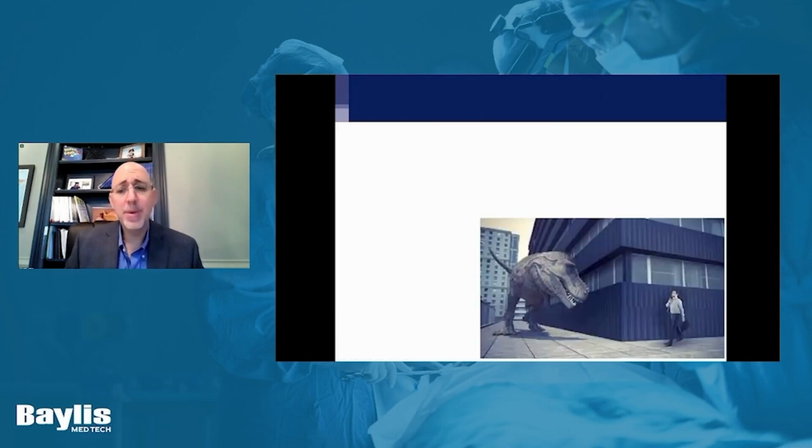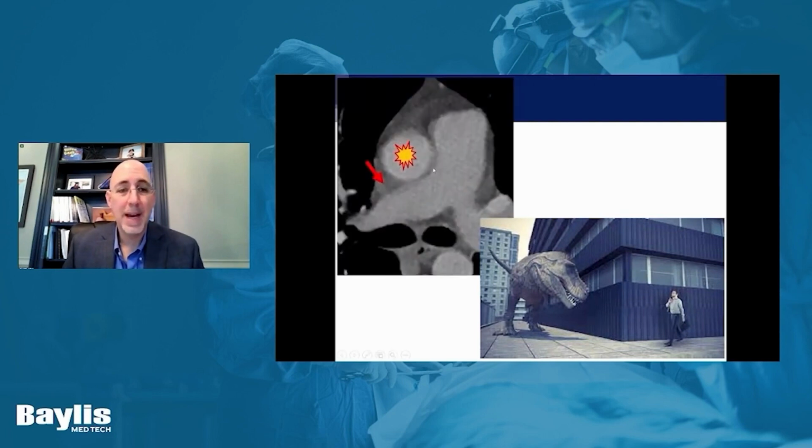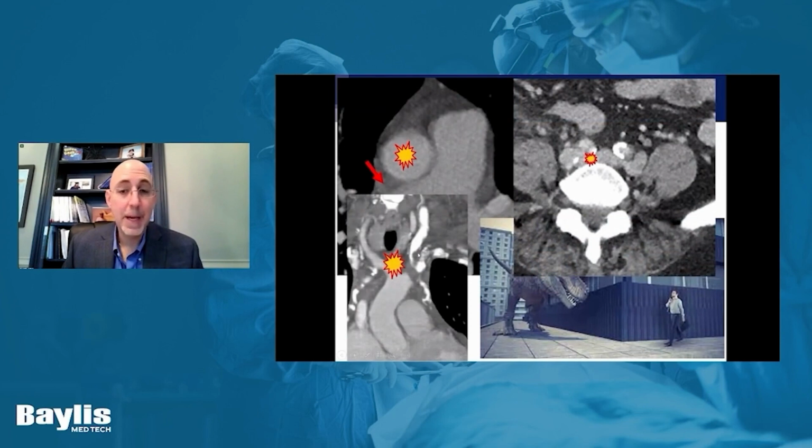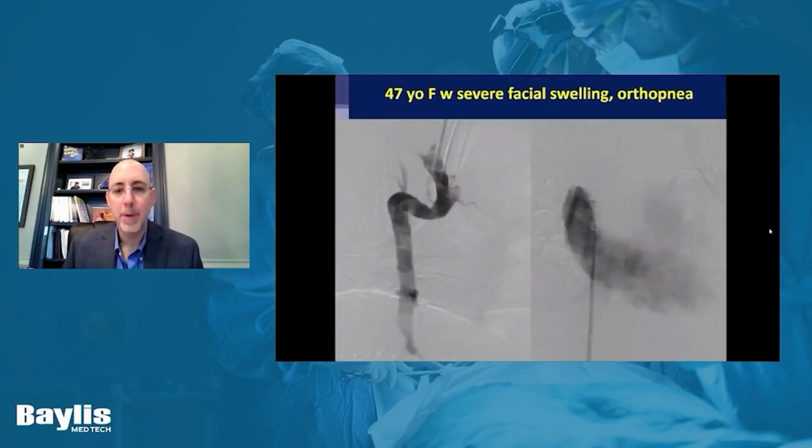Last thing I'll remind you is that there are monsters around every corner. Be careful where you're burning through. A lot of these are extra-anatomic. Sometimes you can stay true lumen, sometimes you can't. Certainly you've got high-priced real estate in the chest. You have high-priced real estate in the iliac veins. You've got high-priced real estate coming from the left brachiocephalic vein. There's a lot of dangers around. So really study your CT, make sure what's surrounding before you make your passes, and certainly before you angioplasty.